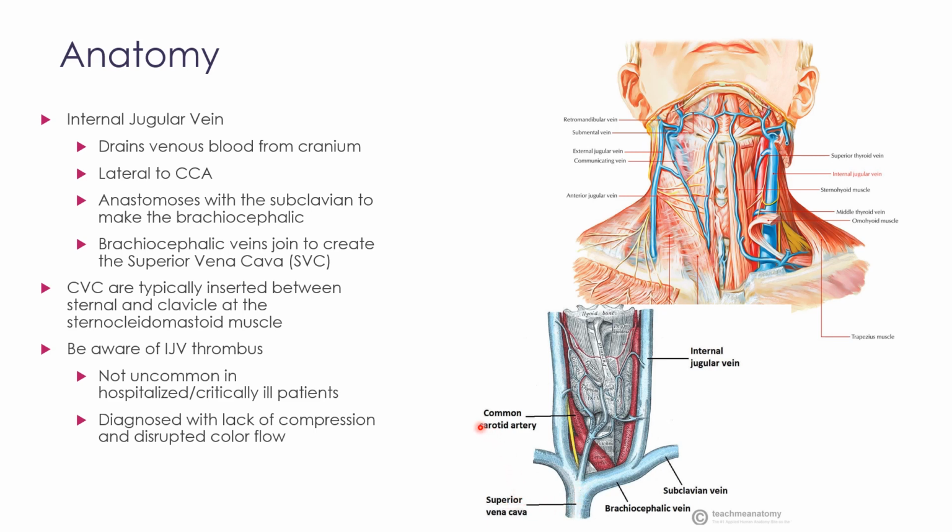Okay. Now, one thing that can happen that you have to be aware of as a practitioner before you put in the catheter is your good evaluation for thrombus. So we know that very sick patients, they're going to follow Virchow's triad. They're probably going to meet one or more criteria of Virchow's triad, including stasis, hypercoagulability, and trauma. So because these patients, it's common to have one or all three, they're going to be at high risk for clot, and the practitioner would certainly not want to put a catheter right into a clot.